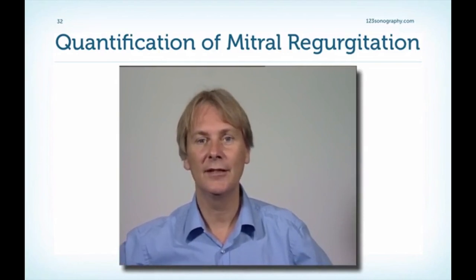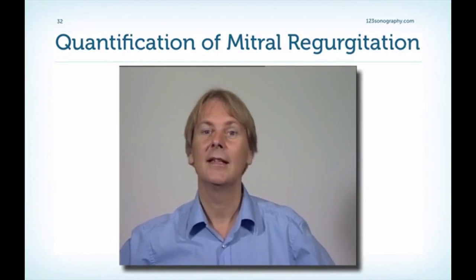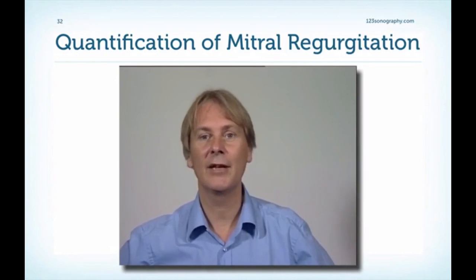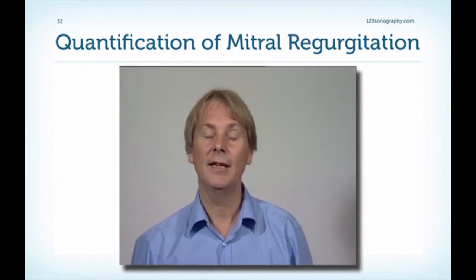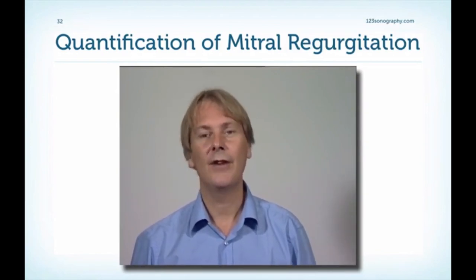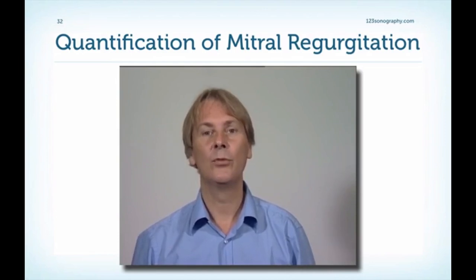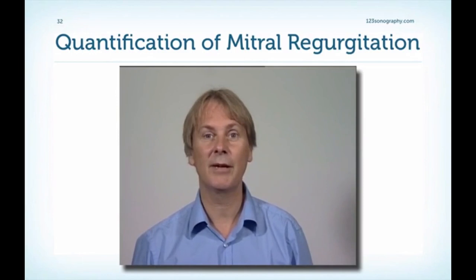And I'll tell you a secret, many colleagues who propose the PISA method and other quantification techniques, in reality don't do it either in their laboratory. Why do I know? Well, they tell me at the bar in the evening. And still, I do believe that you should know how to use the PISA method and the other quantification techniques. Sometimes it does help. And finally, it would be perfect or wonderful if we had a number where we could really quantify the severity of MR, because I believe that would, in reality, help us to decide what we should do with the patients much, much better than we can at the moment. Maybe this is something that will come in the future.